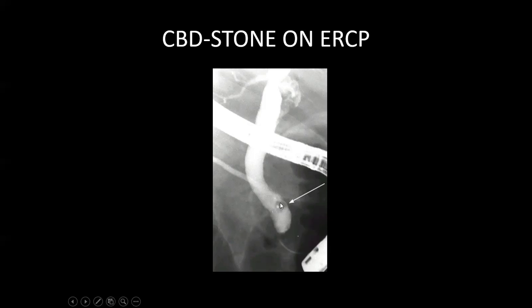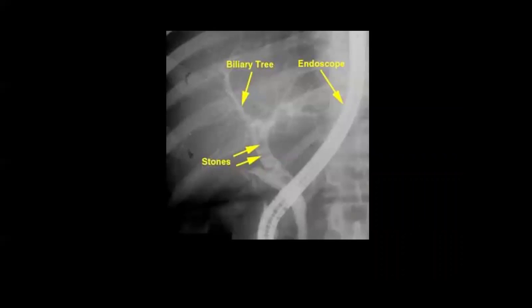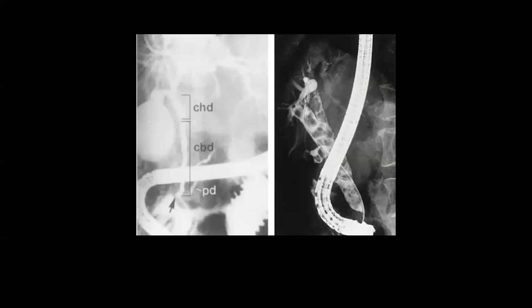Here we have another example where the endoscope and contrast outline the common bile duct. There are multiple filling defects in the common bile duct suggesting multiple calculi — this is the diagnostic component of ERCP. Another example shows a normal common bile duct and pancreatic duct with contrast outlining these areas including the gallbladder and intrahepatic biliary channels. Here you can see the endoscope and dilated common bile duct with multiple low-density areas suggesting multiple calculi filling the CBD causing obstruction.